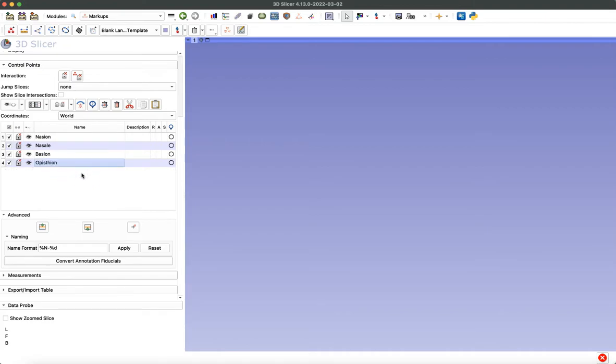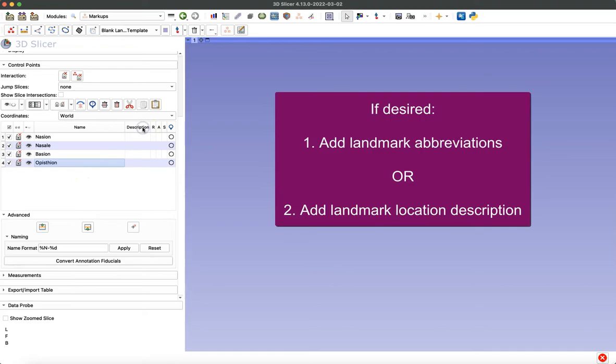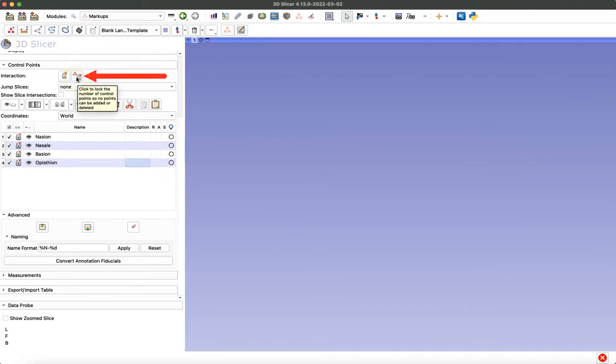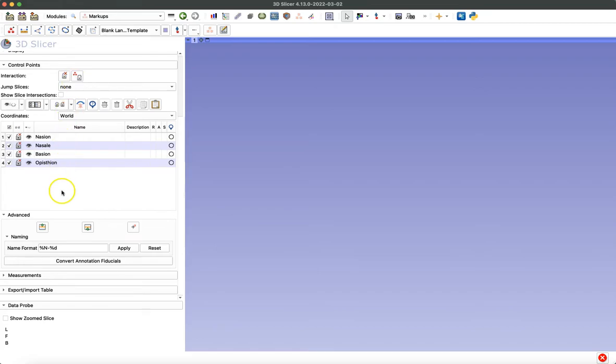Just like before, you have that description section on the right, so you can leave this blank or you could use abbreviations for your landmarks, add a detailed description of how to find those landmarks, whatever you prefer. Next, you want to lock that list so you don't accidentally add or subtract a landmark. By clicking that icon, now when I try to add a few more points, the list remains unchanged. We haven't accidentally added a landmark.